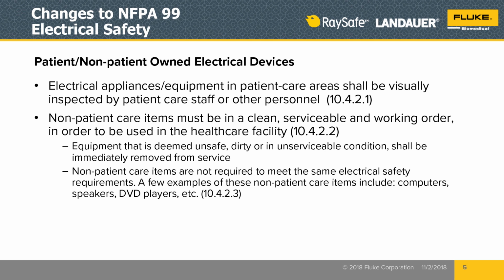We understand a lot of times the clinical staff still call on folks in clinical engineering and the biomed shops to enforce when there's a problem. But the mandate is that all staff should be aware that if it's plugged in and if it has a battery or uses electricity, there is a mandate to be aware that it is safe.